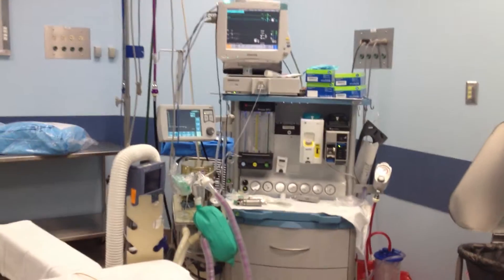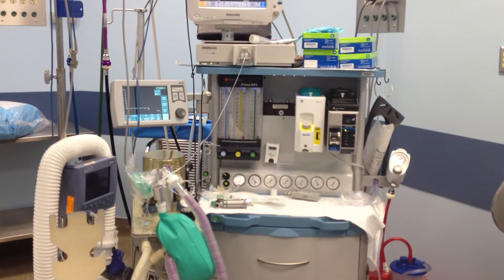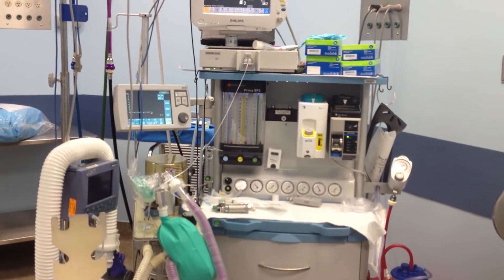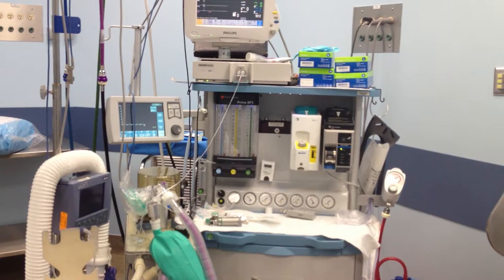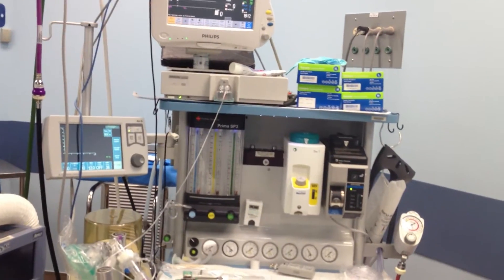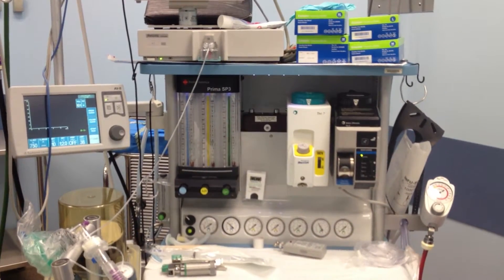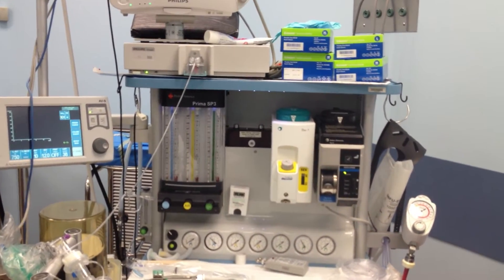Here we are again in OR3, looking at this device here — the Penlon Prima SP3.